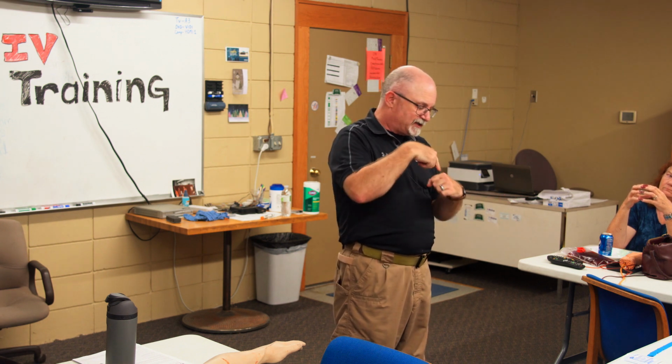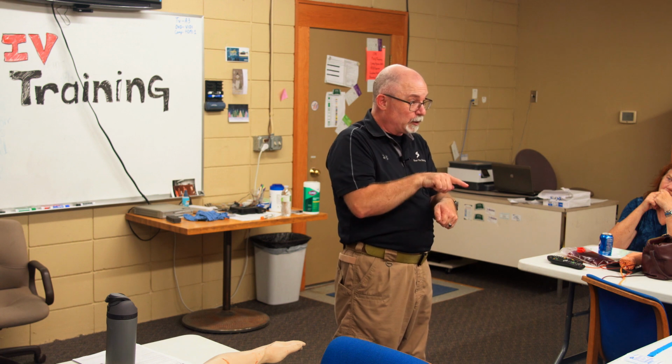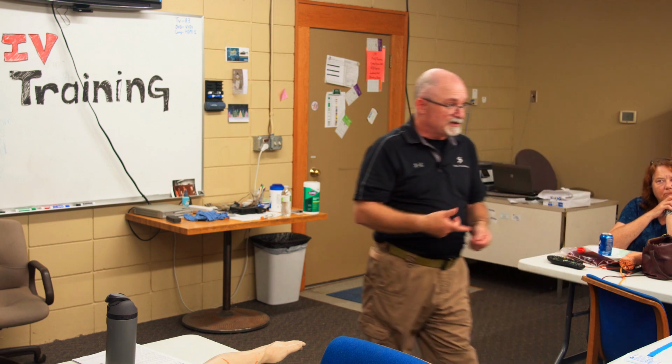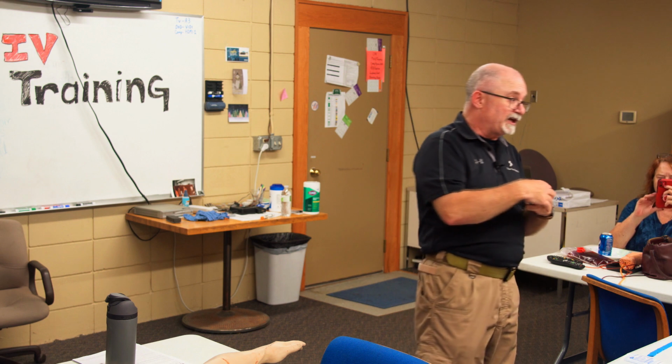But sometimes being able to thread, so you'll poke in here and you'll start to advance and all of a sudden it'll stop. So you may have popped through the other side and you're going into tissue, or maybe you're in the lumen, but now you're up against a valve and you can't get it to float past the valve. So sometimes you can do what's called floating it in. You can hook it up to your solution, or you can use a flush if you have them. You guys don't have those now, but you can float through there sometimes. If you can't advance, don't force anything, but if you're almost there and you're already hooked up, maybe you can float it in. Early on, I don't know that I would suggest that. If you can't get a clean advance, just start over, try a different spot.